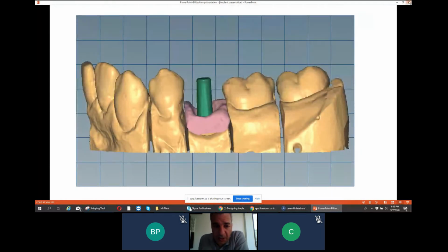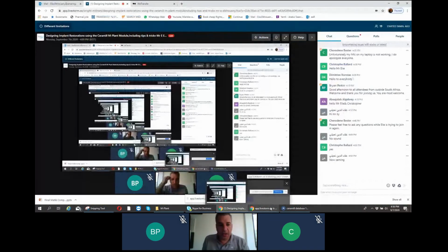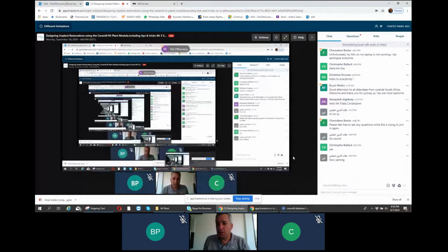I will close the presentation and we will start the software. If you have any question before starting, just let me know.